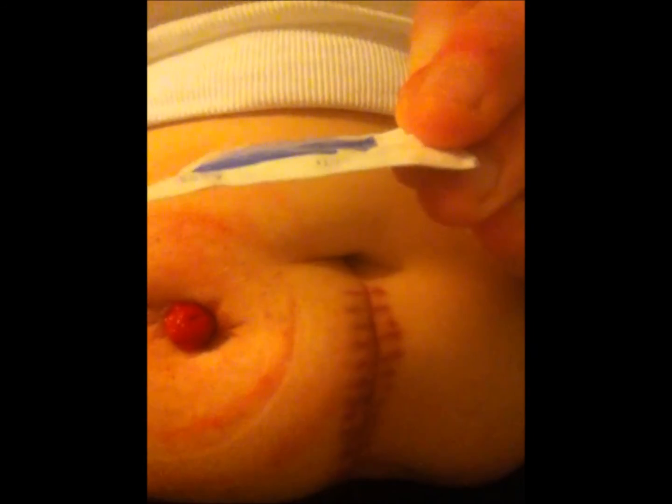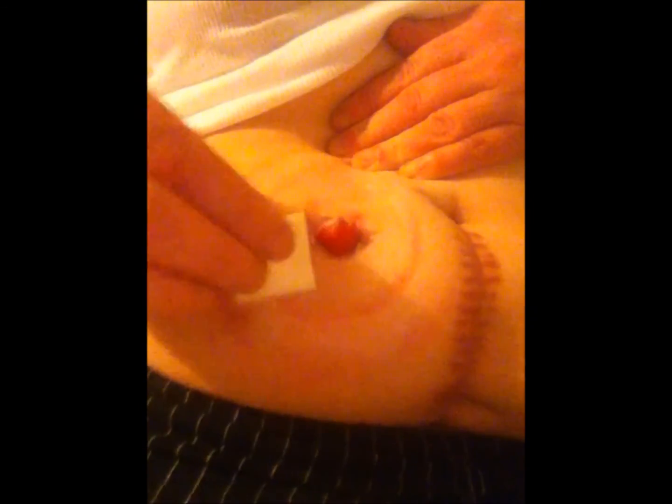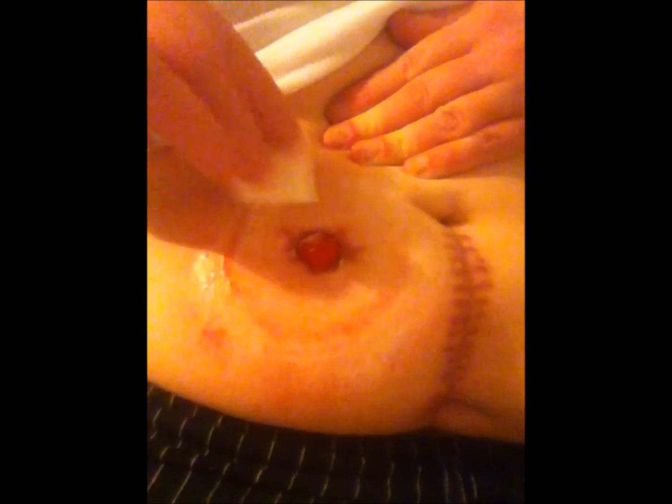And now that I've done all that, I have my no sting barrier film. Now what this is, I take it and I open it, and it's got a little sponge inside. And the reason for the sponge is it has a particular kind of film on it that helps to make a liquid Band-Aid. And here is my stoma powder, and when I put that powder around my stoma, don't worry about that, if it hits my stoma, it doesn't hurt anything. I put the powder around, and then I use this little sponge and I dab it on there, and when I do that, it creates a liquid Band-Aid for me.